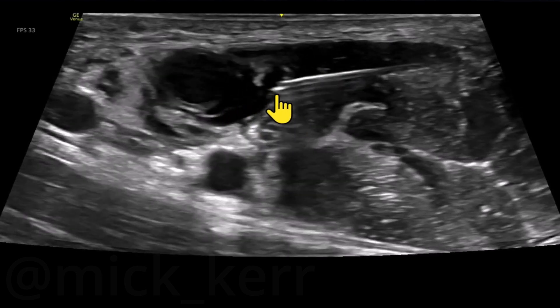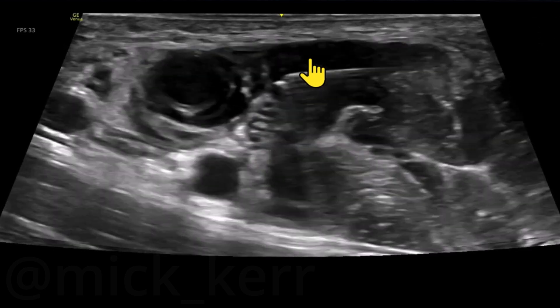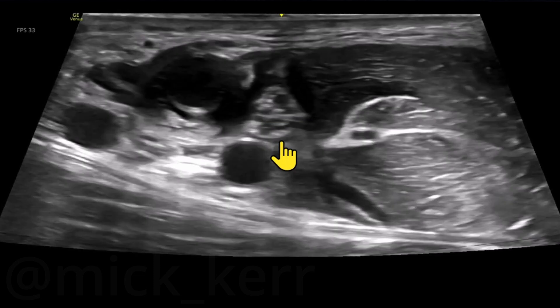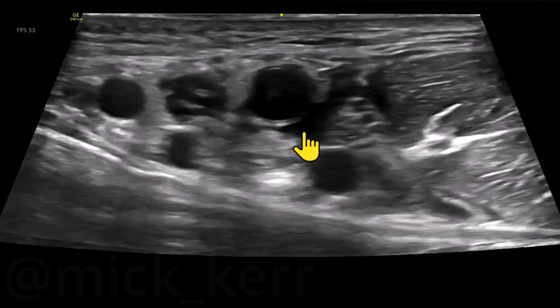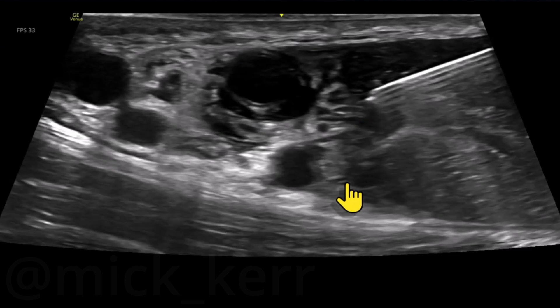It's not exactly bathing the median nerve, so what I'll tend to do now is pause and reassess — have I got enough work around the nerve? It's a reasonable amount, so I'm happy with that. Now I'm going to look around for the ulnar and the radial nerve as well.